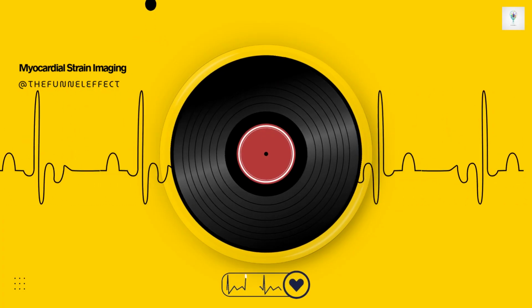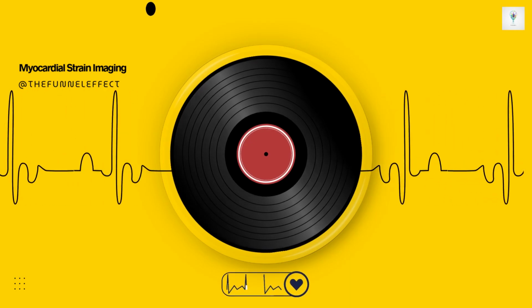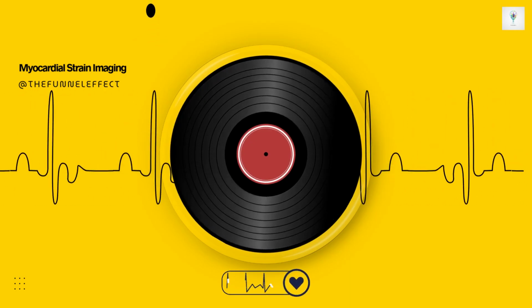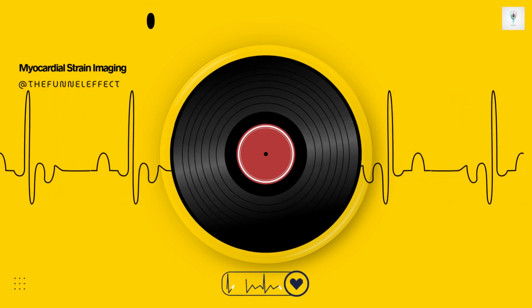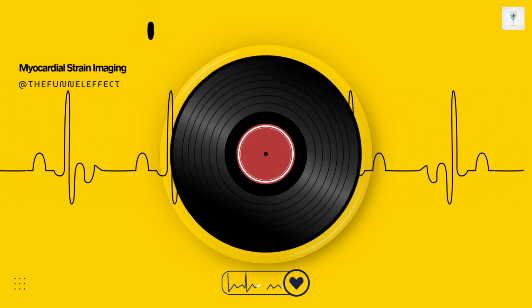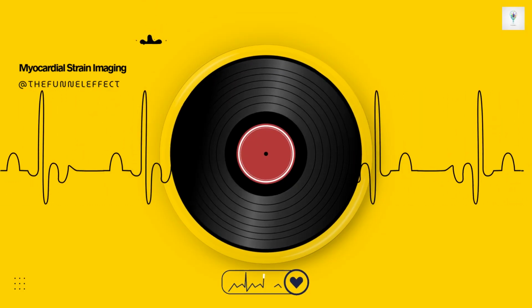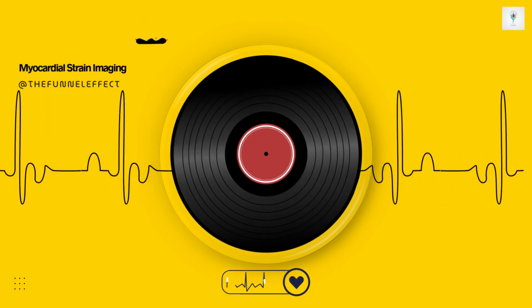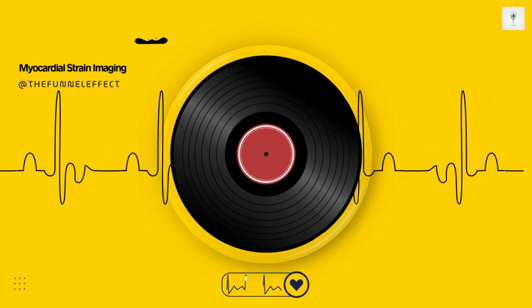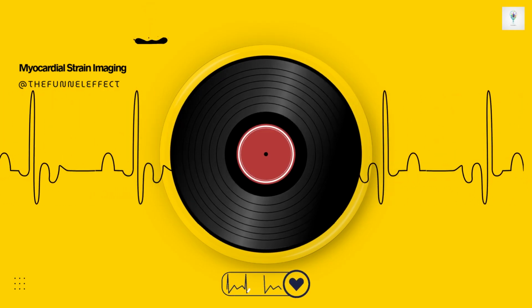Okay, post-systolic shortening. That means the muscle segment is actually contracting after the aortic valve is closed, when systole is supposed to be over. Exactly. The main pumping phase has ended, but this segment is still shortening. What does that late, out-of-sync contraction signify? Well, PSS can sometimes be physiological, just reflecting normal elastic recoil after being stretched. However, when it's pathological, related to ischemia, it typically represents one of two things.